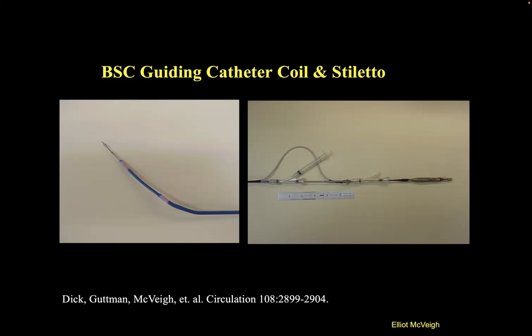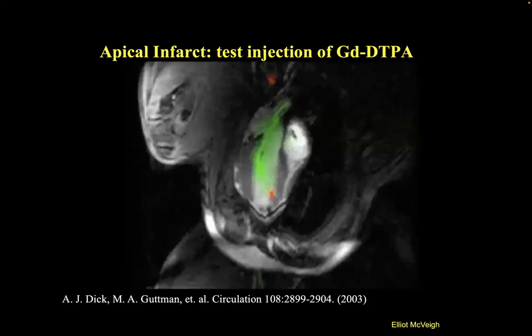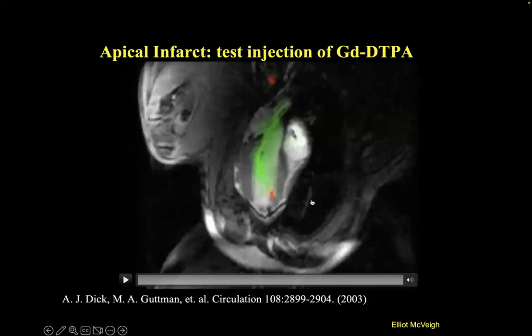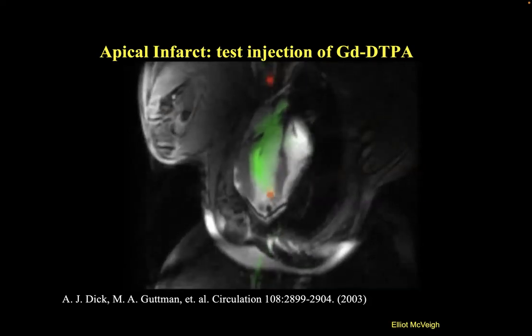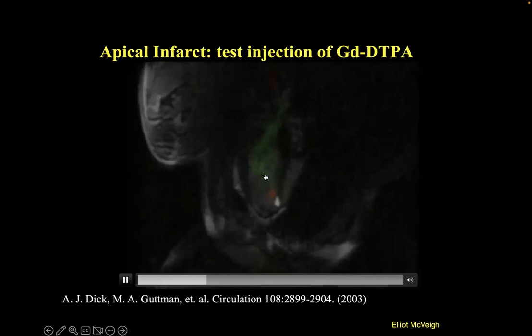So ideally, we created a coil that went along the shaft of the catheter, right? And then we took the signal from that coil, put it into its own receiver, and then that image we would in real time display on top of a real-time MR image during the same procedure. And so this is real-time images coming out at about 7 frames a second or something, with real-time images of the catheter on top of it, right?